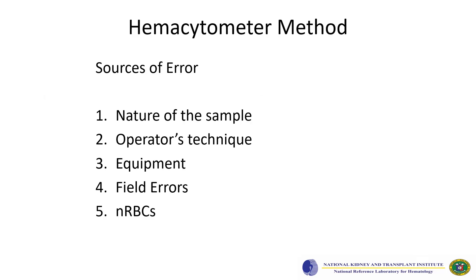The hemocytometer method comes with a lot of errors. The sources of error are: the nature of the sample, the operator's technique, the equipment, field errors, and the presence of NRBCs.